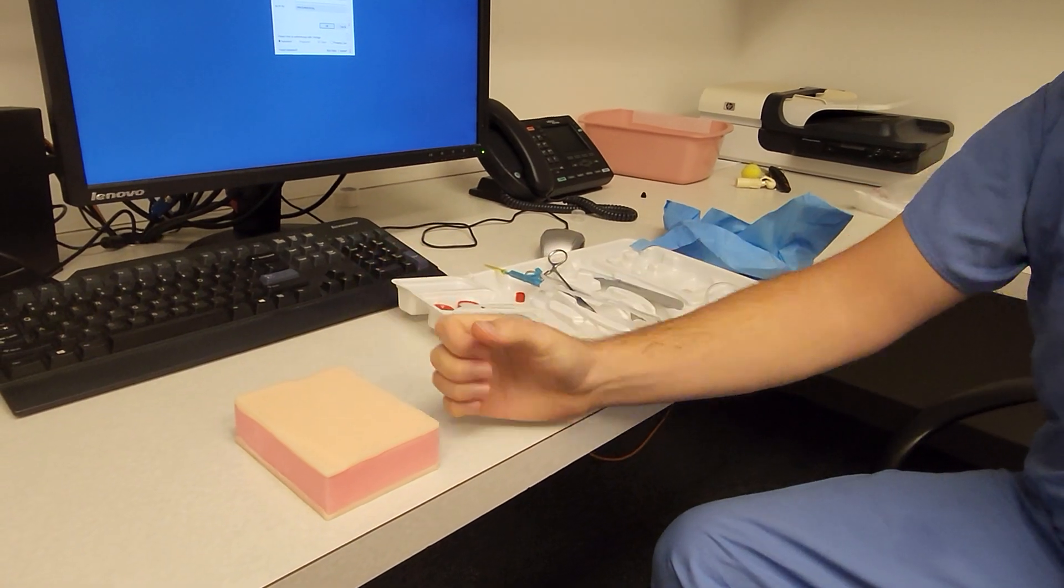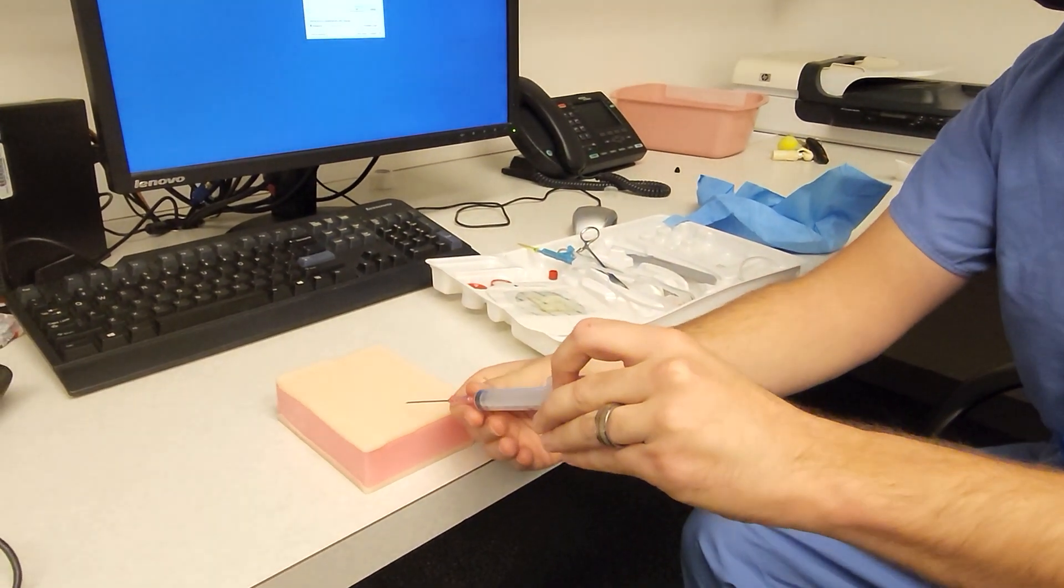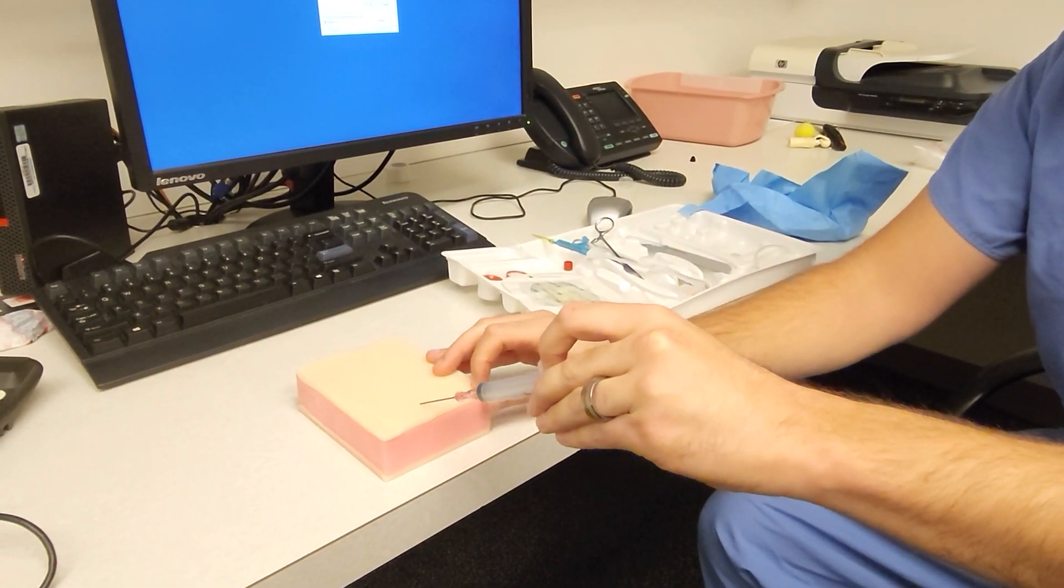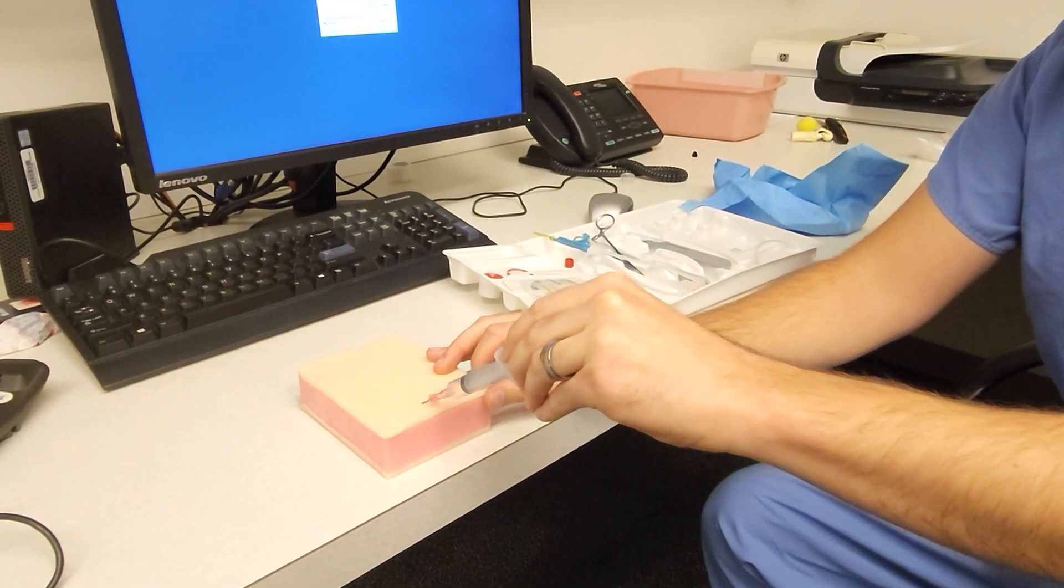You're going to use the ultrasound to look for the artery and then same technique as a central line except going at a much shallower angle, aspirating as you insert until you get flow.